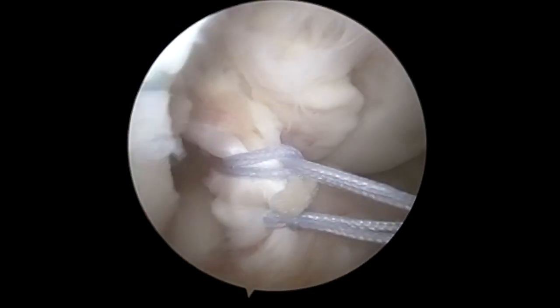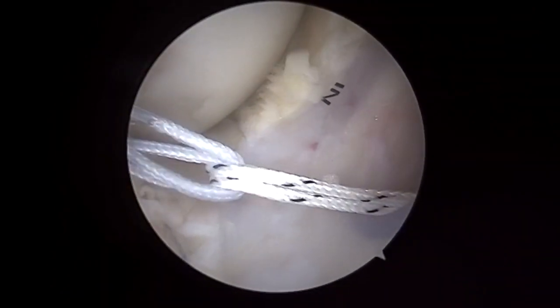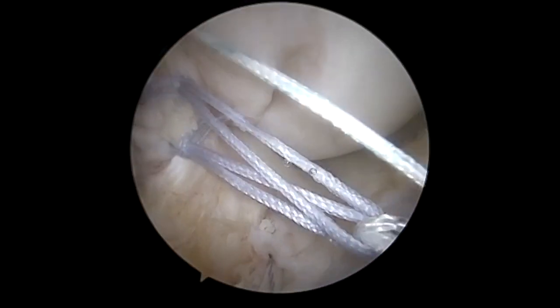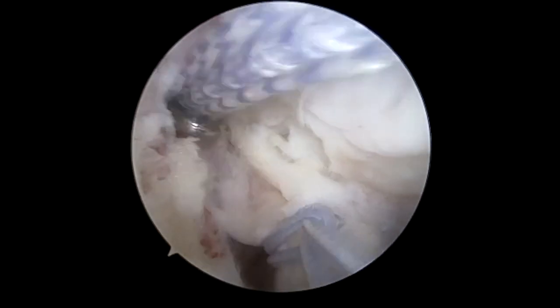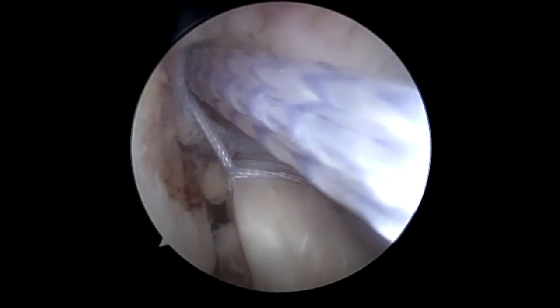Then we're going to pull both of these through the passport. Following this we're going to engage both fiber rings into the tightrope, bring the button all the way to the lateral cortex, flip it, and get an x-ray to confirm.